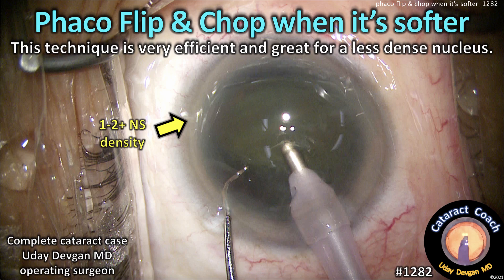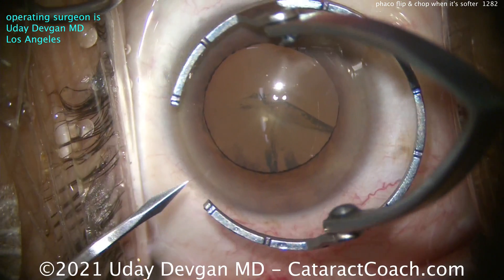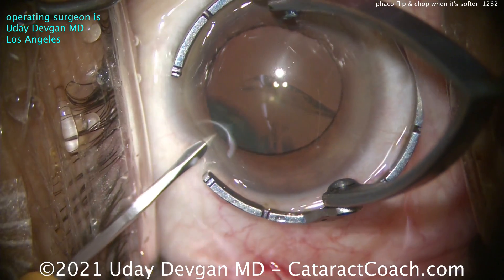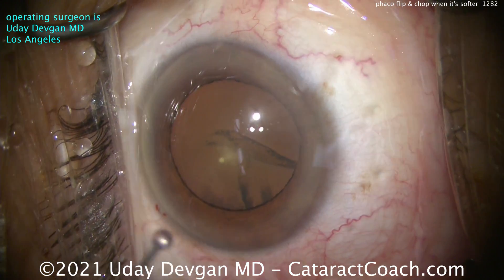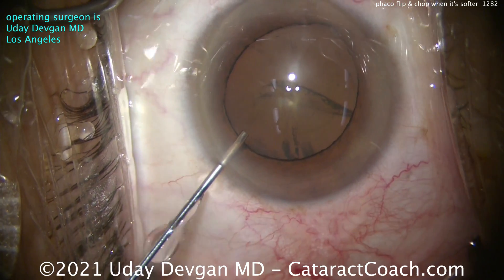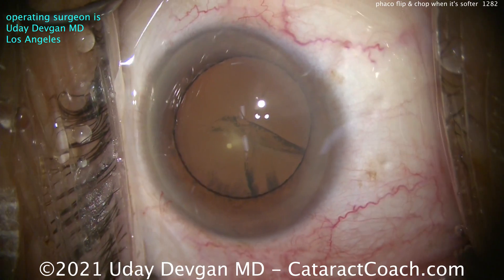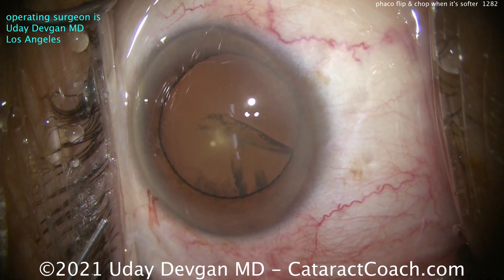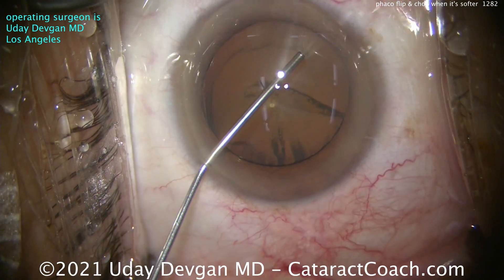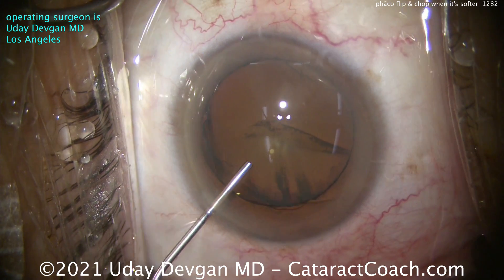FACO flip and chop when the nucleus is softer — this technique is very efficient and great for a less dense nucleus. Here's a patient with only about a 1 to 2 plus nuclear sclerotic cataract. Yesterday's video showed a little bit more density, 3 to 4 plus NS, and this one's a softer lens. You can see that big cortical spoke right in the center of the visual axis — that's why the patient is seeking cataract surgery. That spoke is distorting vision and causing tremendous glare. Cataract surgery is being considered at an earlier stage with less nuclear sclerosis.